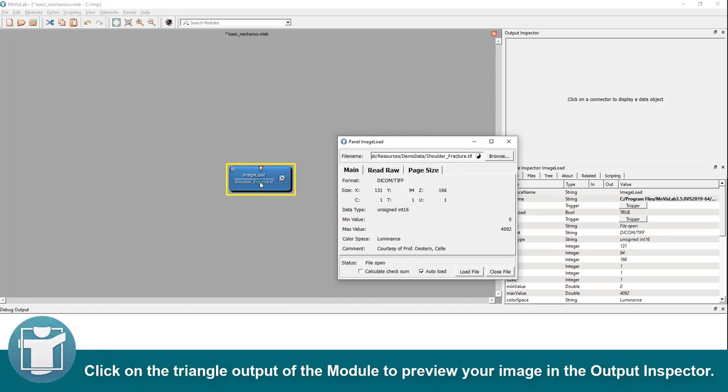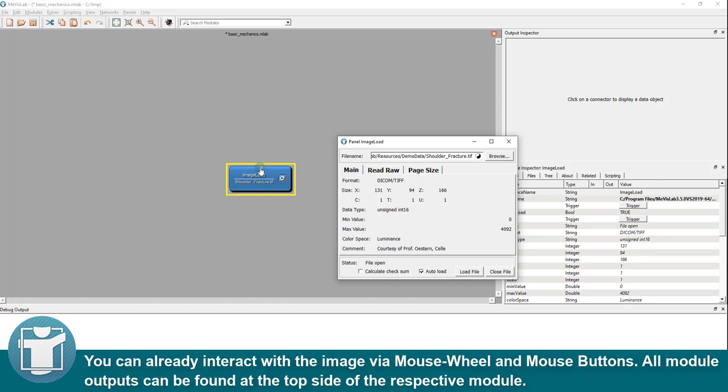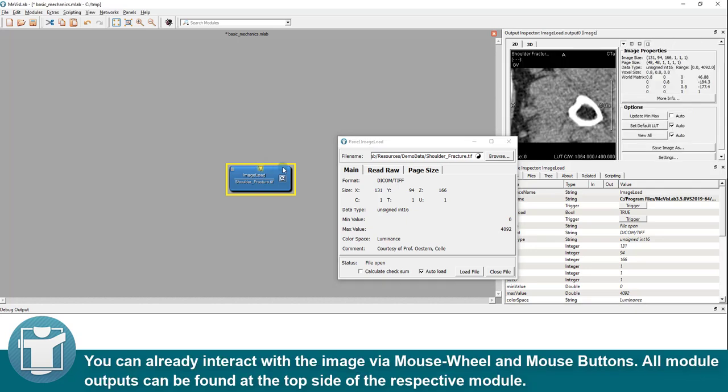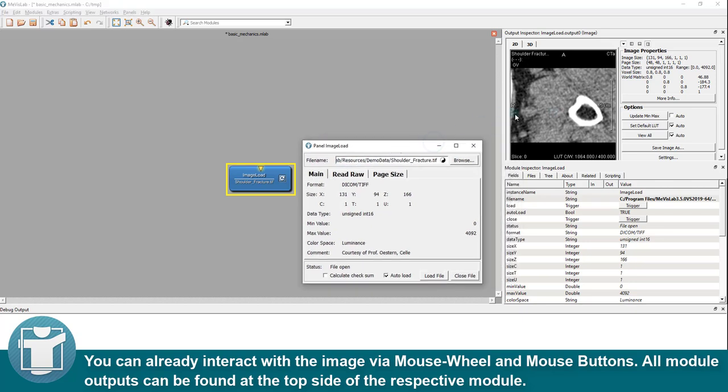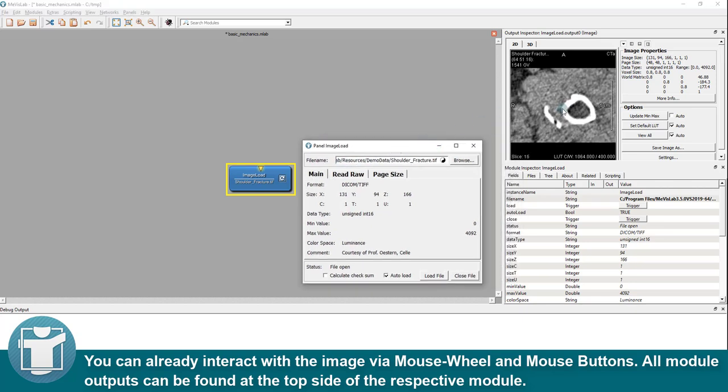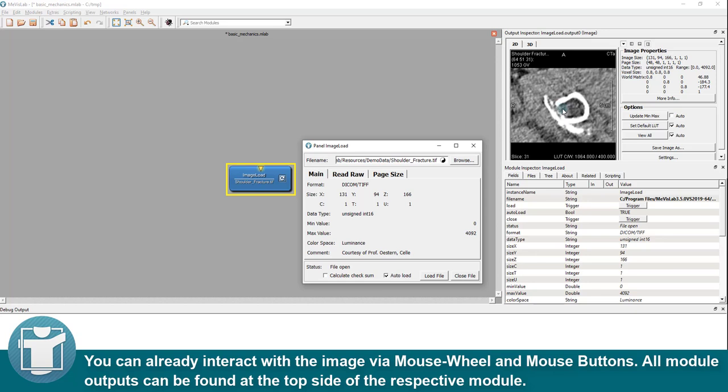Click on the triangle output of the module to preview your image in the output inspector. You can already interact with the image via mouse wheel and mouse buttons. All module outputs can be found at the top side of the respective module.